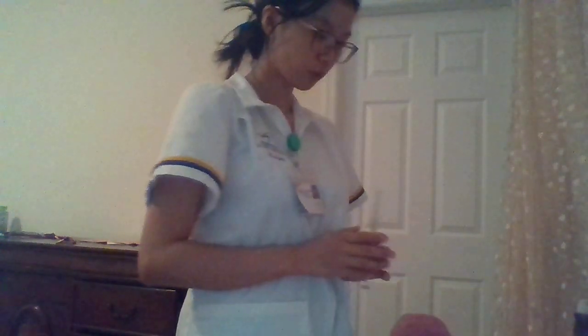And before I administer my medication, I'm gonna make sure the patient is in a good position to receive the medication. So I am gonna ask the patient to relax and put the arm on a firm surface, and then sit down. And I am gonna check the 6 rights again.